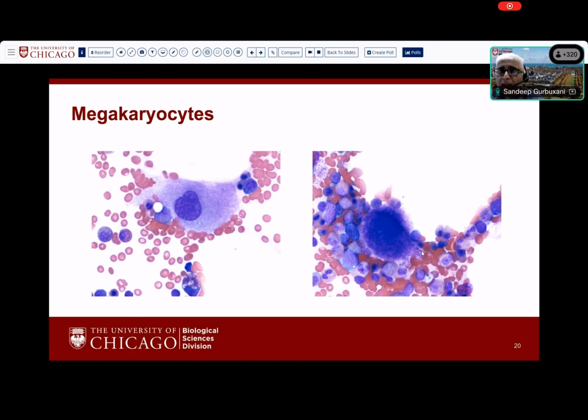We haven't quite gotten to hematogones yet, not in this field, but we have this immature megakaryocyte here, which has much more dark blue cytoplasm, and it's so dark that it's obscuring the nuclear detail. These smaller megakaryocytes that are blue sometimes may have non-lobated nuclei, and they shouldn't be considered as dysplastic. They are immature, and you recognize the immaturity by the presence of this really dark blue cytoplasm.